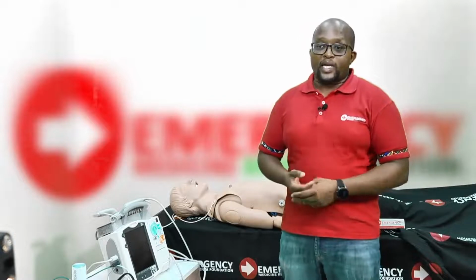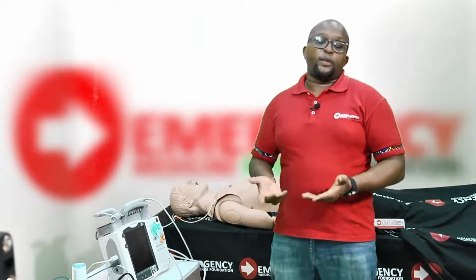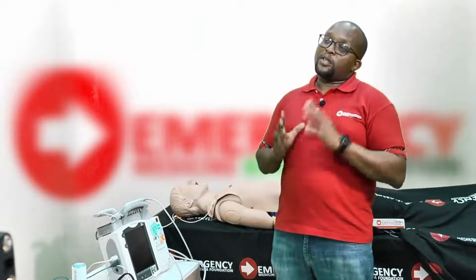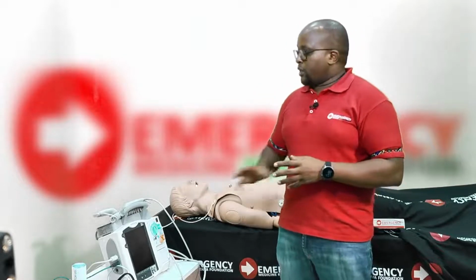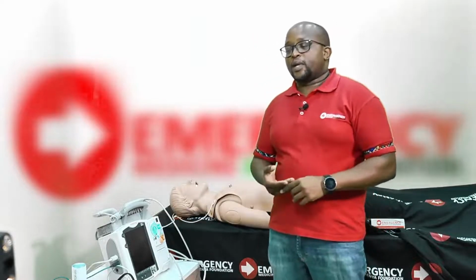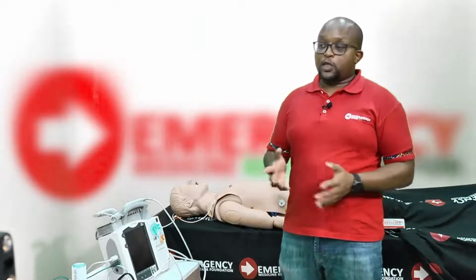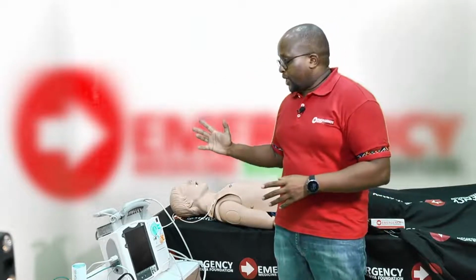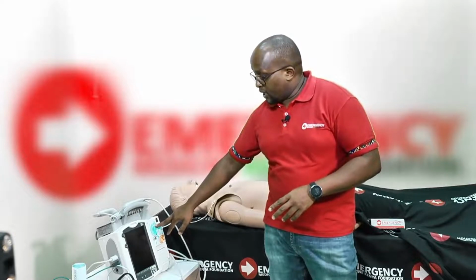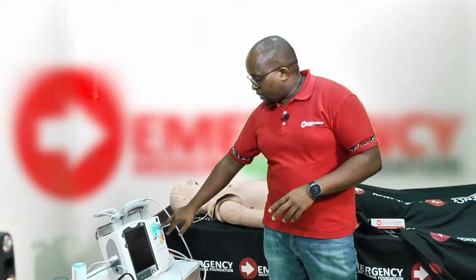Should you identify whether you have a monophasic or a biphasic defibrillator? Yes, because the joules you require to shock the patient slightly vary. If you're using a monophasic defibrillator, you'll probably start off at 360 joules. If you're using a biphasic defibrillator, you use what the manufacturer recommends, which is marked on the defibrillator, normally something like an adult dose.